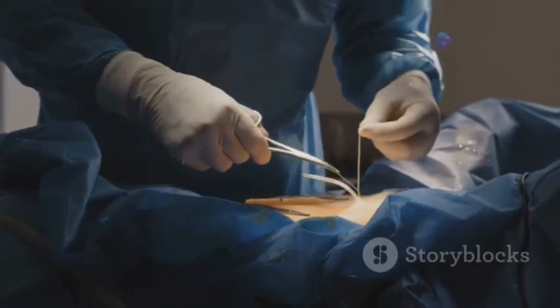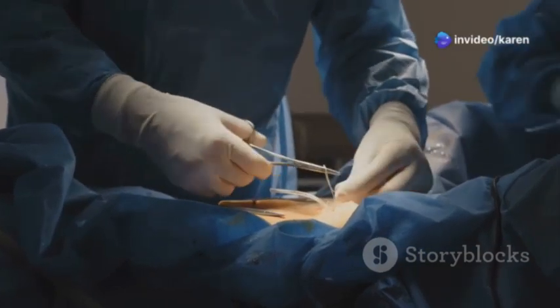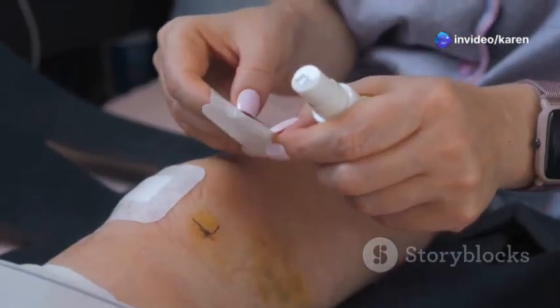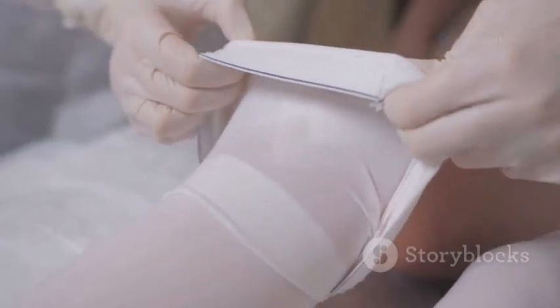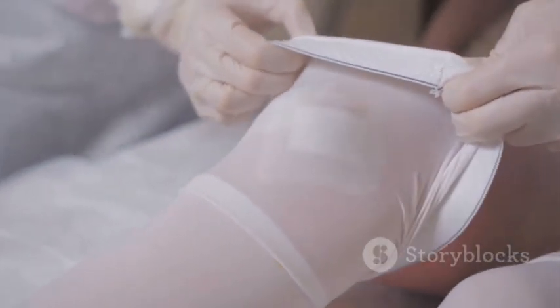Once the suturing is complete, the wound is cleaned again. A sterile dressing is applied to protect the wound and promote healing. Proper wound care instructions are given to the patient to prevent infection and ensure optimal healing.